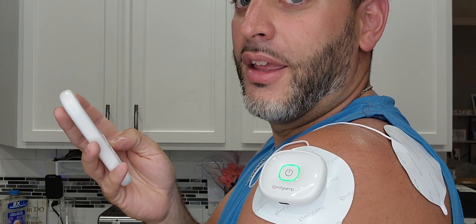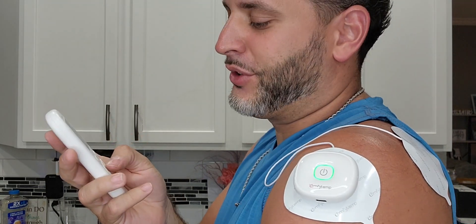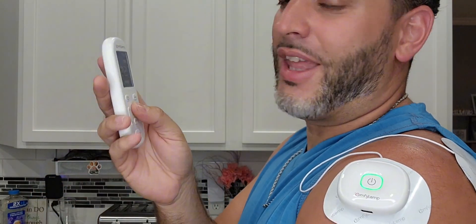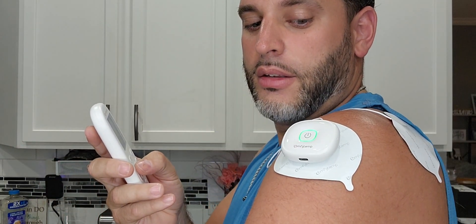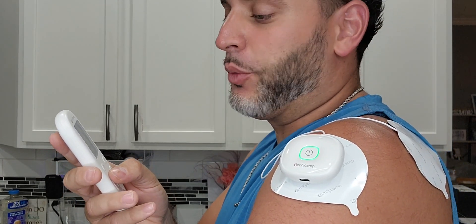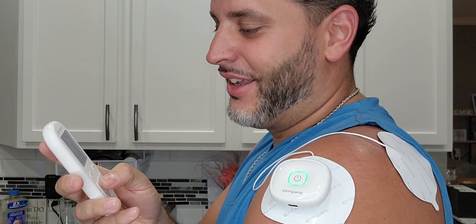If you put it up too high you end up seeing your muscles kind of move around a little bit. You just pick the intensity that you want. If you want to set the timer, we can set that for 20 minutes, and then you can go ahead and play around with the modes. That thing is moving — there's your little pulsating one right there. There's just so many different ones. That one feels amazing — I have not tried that one before.